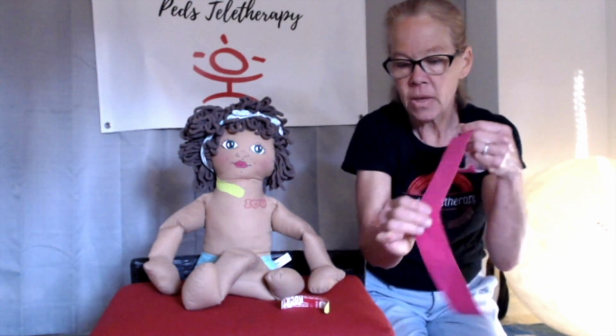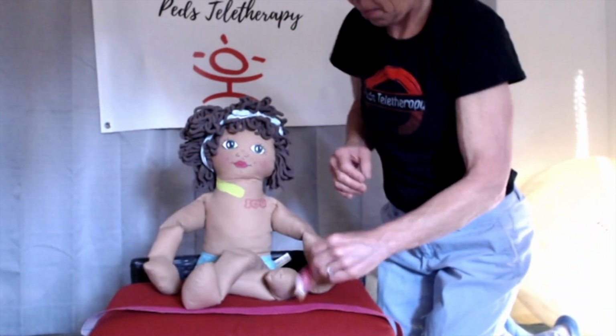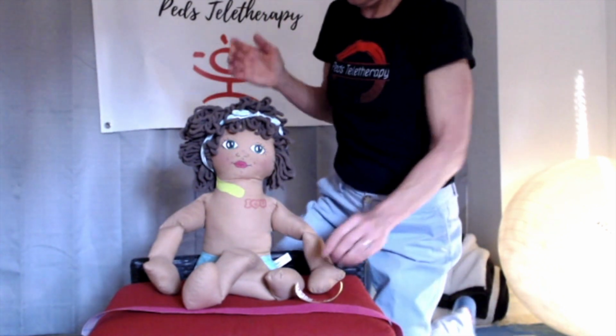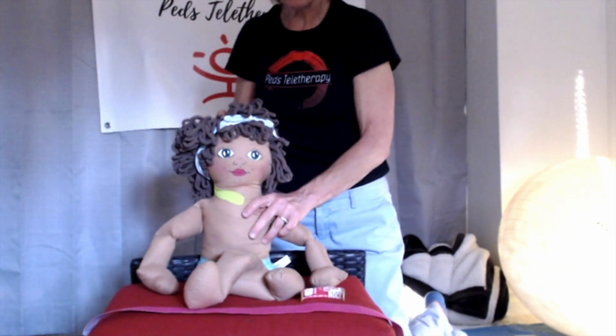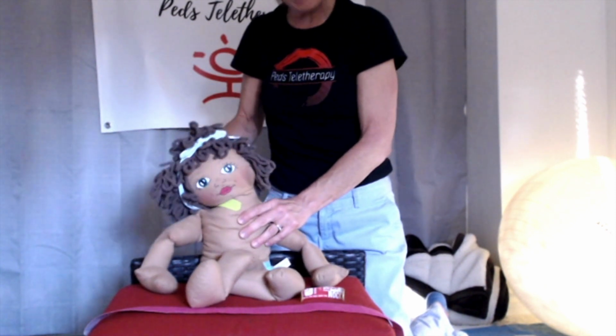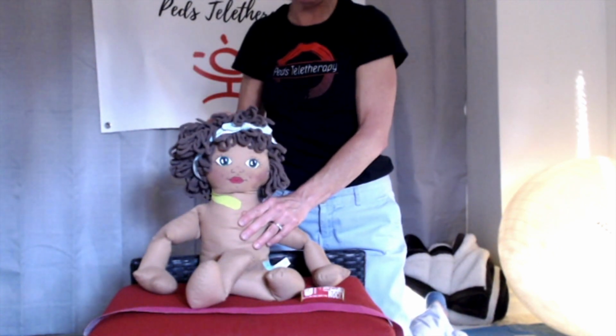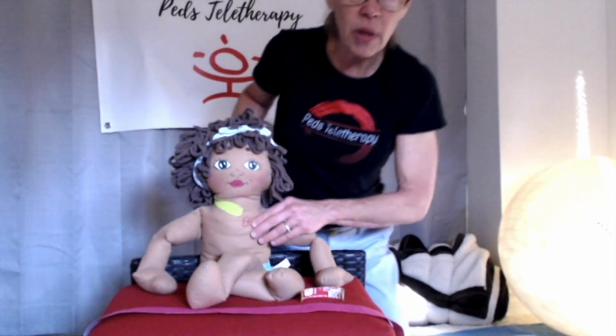Okay? So if I have my display, and this is my wonderful doll, she has a right-sided torticollis. She's tending to want to bend or flex her neck to the right side instead of keeping it in midline. You're playing with the baby and you notice frequently she's over here. You might also notice when you try to get her to go this way, it's tight. She doesn't want to go to the left.